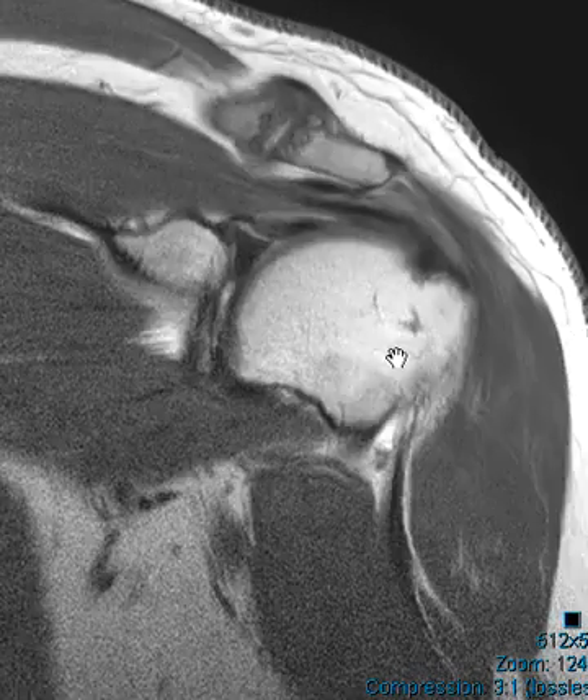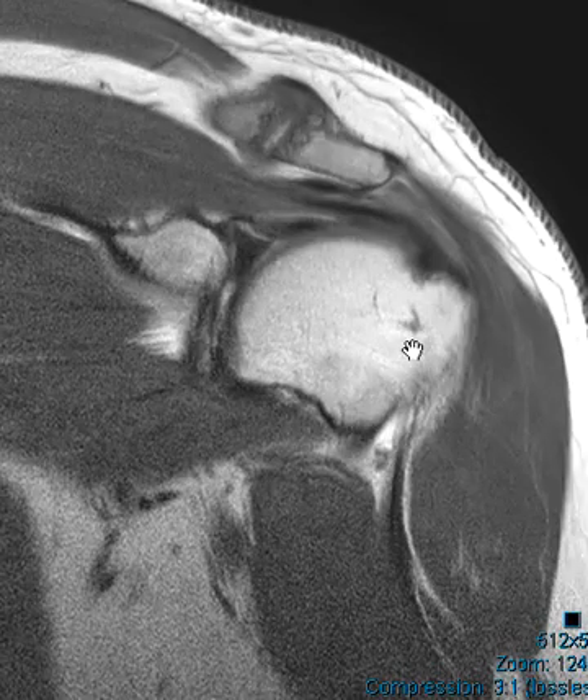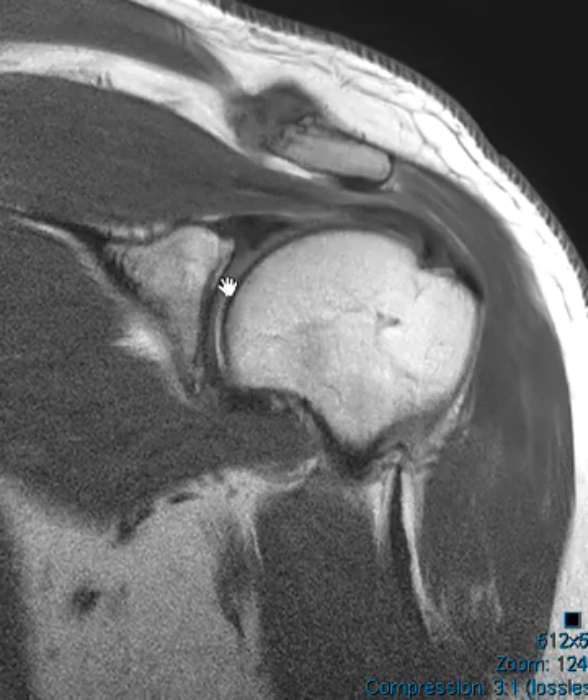Just about arthrograms in general — when I was taught in residency, I think we had a 22-gauge spinal needle we used, and we would oblique the patients and went towards the joint.